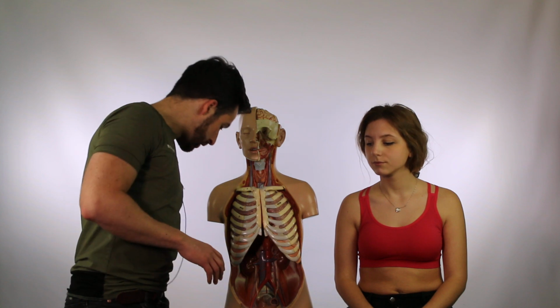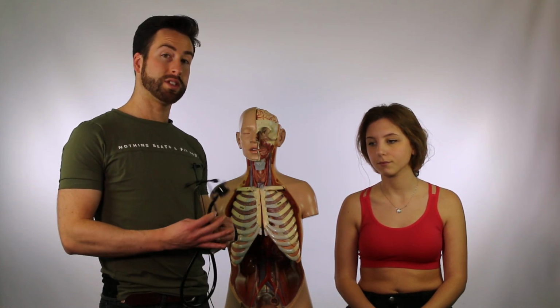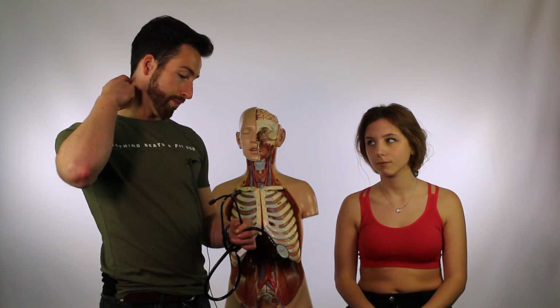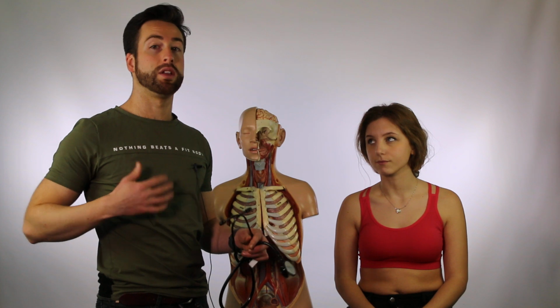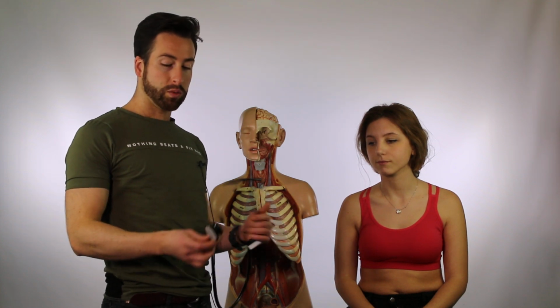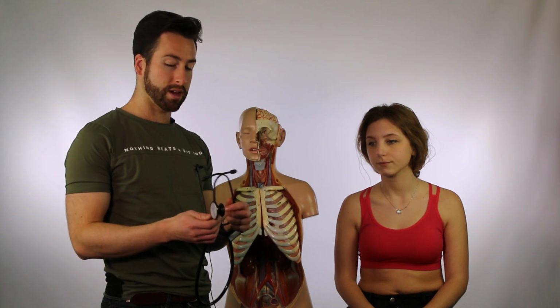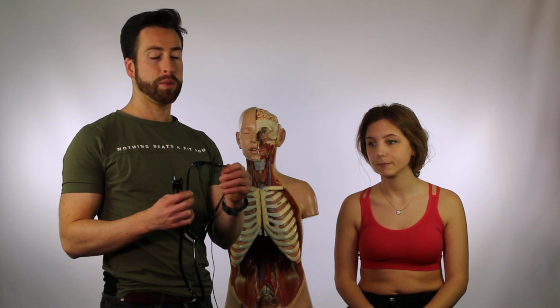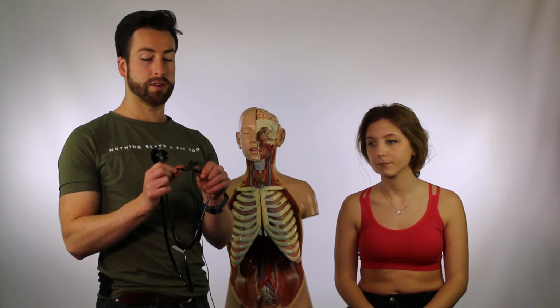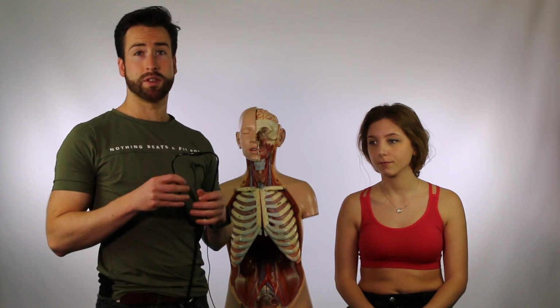Before we auscultate, I'm just going to introduce it. First of all, this is the device that we use to auscultate, which is called a stethoscope. You can also auscultate different areas, but we're going to focus on the lungs today. We use the diaphragm part, which is the flat part, to auscultate, and we make sure that the earbuds are pointing a little bit forward, so there's a better transmission of sound into the ears.